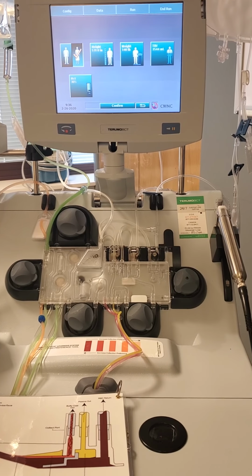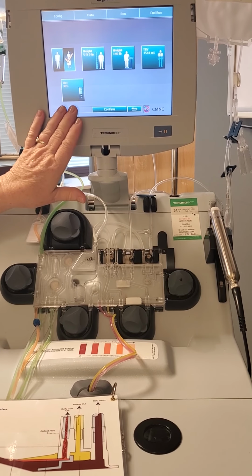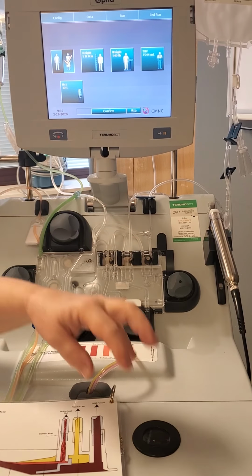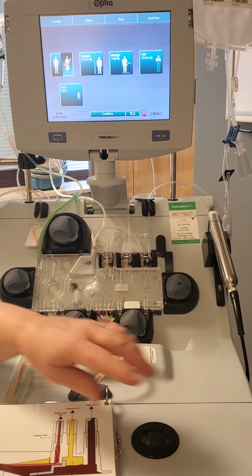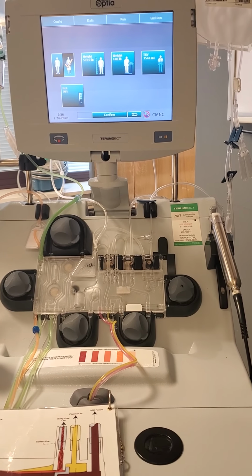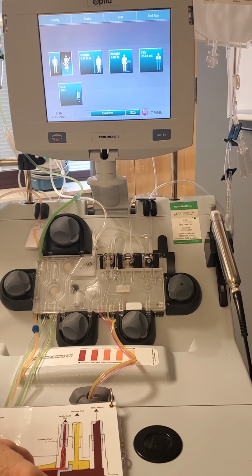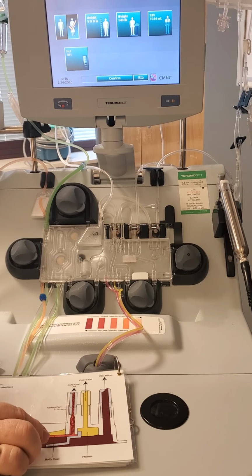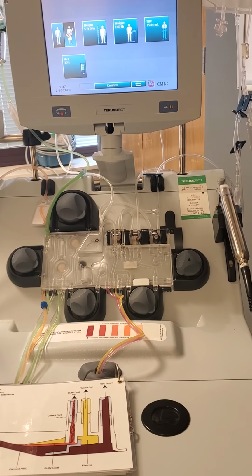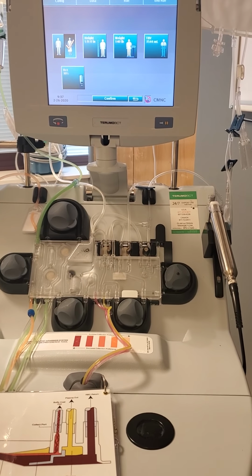And most people, if they're not familiar with the importance of this piece of data, struggle with troubleshooting it. Hematocrit is the usual culprit for an inaccurately placed interface. So if I've guessed correctly at too high a hematocrit, the red cell layer will be way low. It won't be in its proper position, and we should get an alarm. Keeping fingers crossed, I don't know if I set it high enough. We could do 40 if you wanted, but then the troubleshooting is going to be inaccurate.